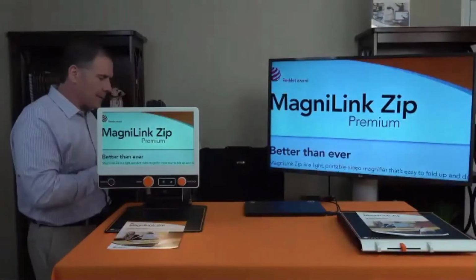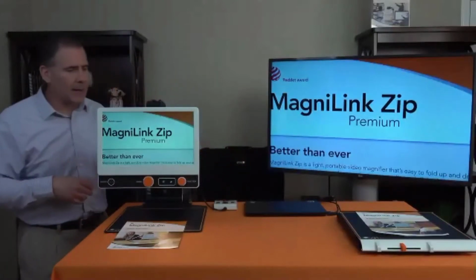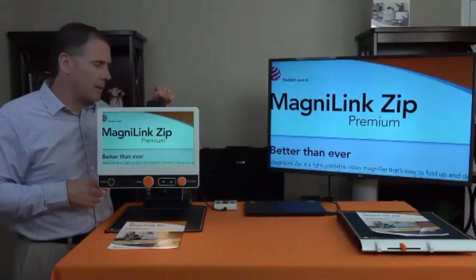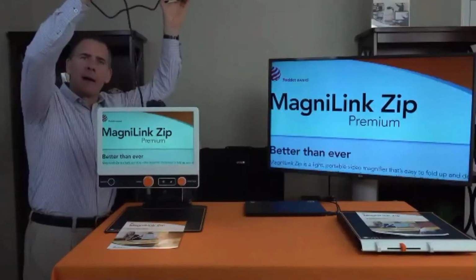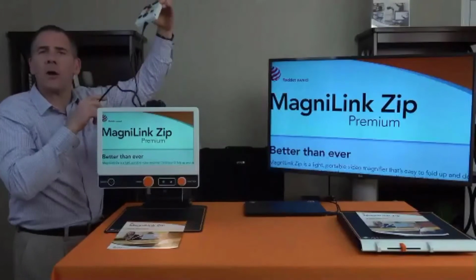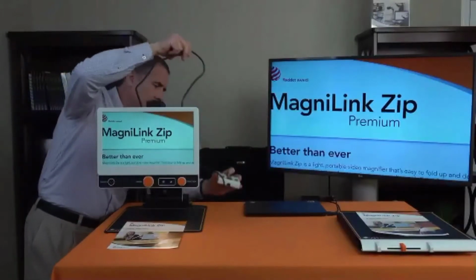Now, the Zip. I have it plugged in right now. I have this plugged into the back behind the screen. It's like an RJ45, like a big phone plug, and it clicks right in. That's one plug plugged in.